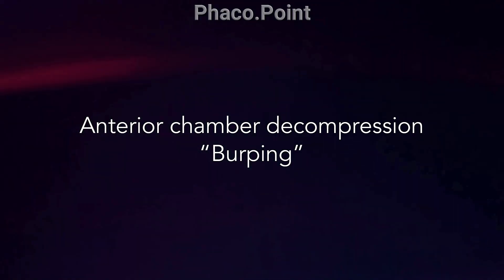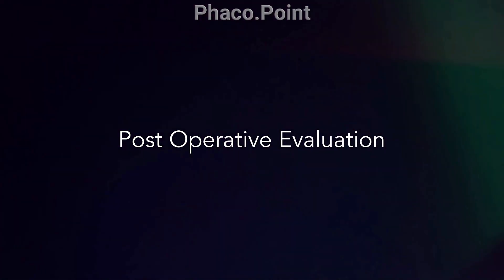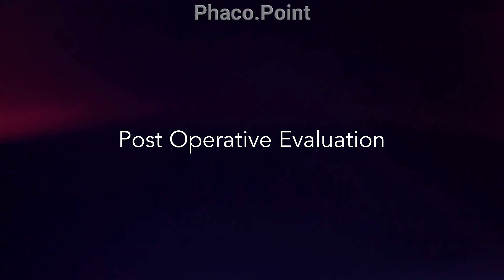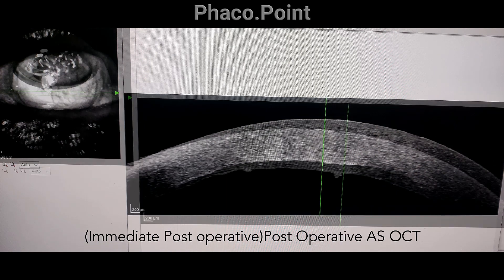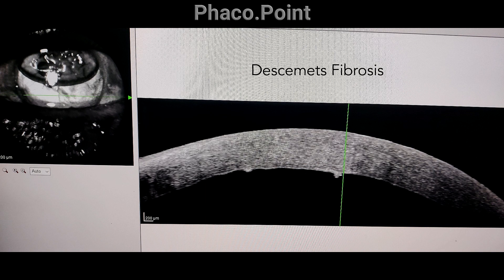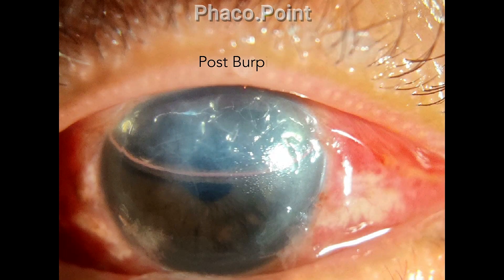Burping prevents the chances of a post-operative pupillary block. These are the post-operative OCT images — the Descemet's membrane seems to have flattened significantly, though note the presence of fibrous folds which still exist. This is what the cornea looked like four hours after the surgery, and following the burping to reduce the quantum of air in the anterior chamber, the central part of the cornea seems to have cleared quite a bit.